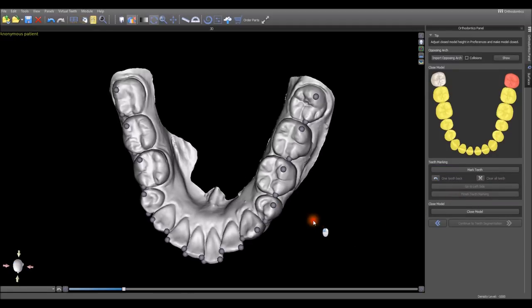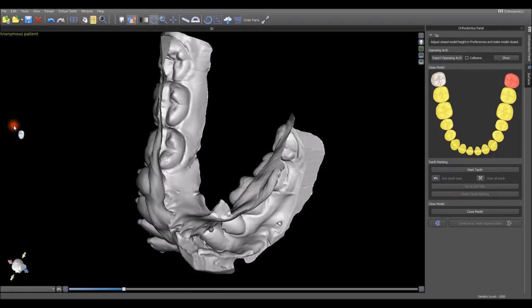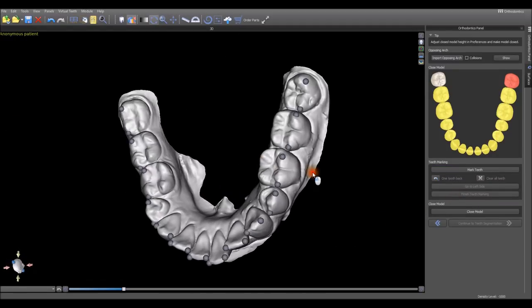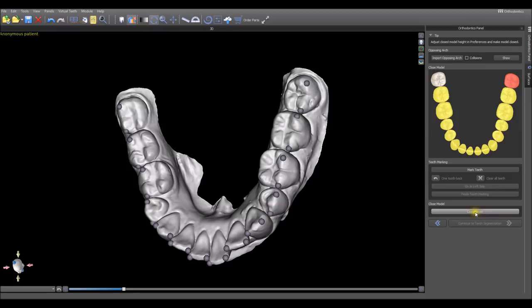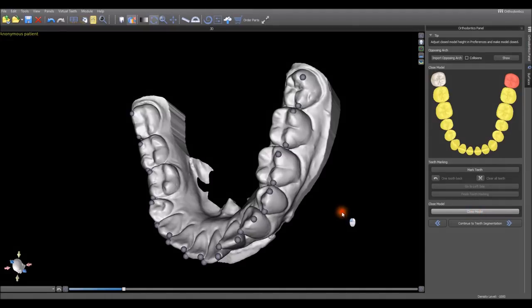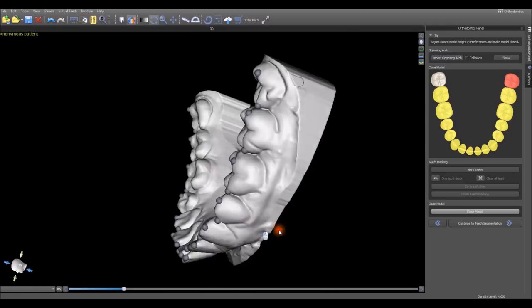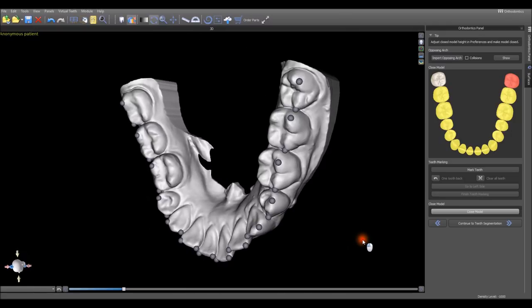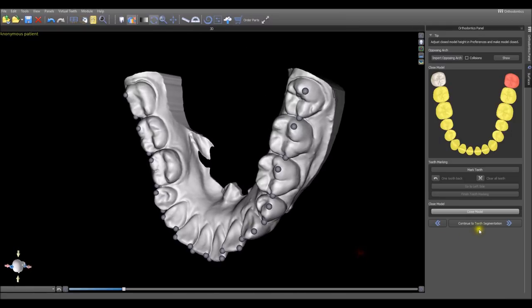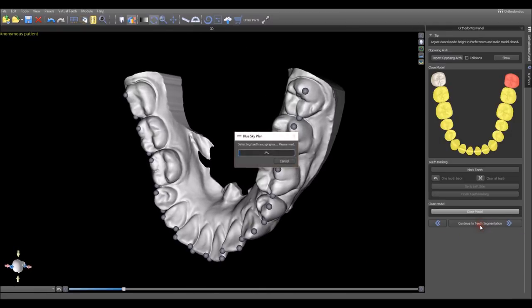We can add a base to the model by clicking Close Model. Now we've marked the corners of the teeth, we have our base added. We click Continue to Teeth Segmentation.